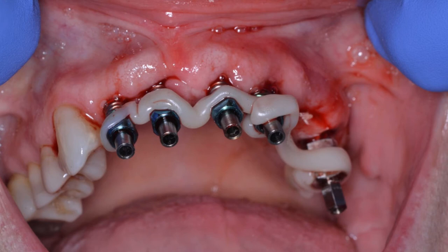VLC, visible light curing polymethyl methacrylates. The problem with those things is there's crazy shrinkage with those. So you're going to get some distortion with this as a verification jig. So use pattern resin if you can afford the time to use it. I just like using composite resin. So as you can see, just do something like this. Yeah, it costs you more money, but you know what? It takes time to mix pattern resin as well. So that's the way I see things, but this works fairly well for me.